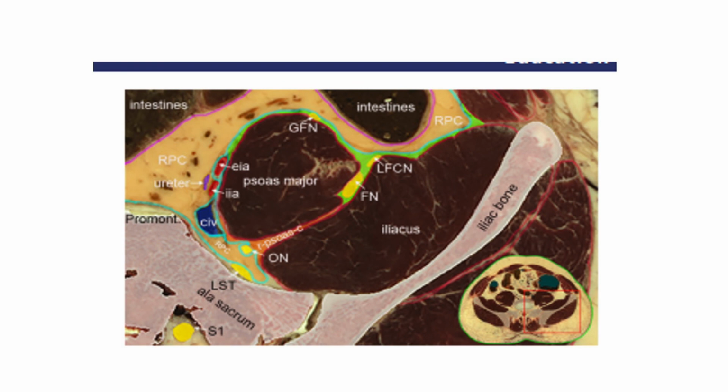So, as we can see here, the fascia iliaca is denoted by this green line. Like this. So when we block the fascia iliaca compartment, we block the lateral femoral cutaneous nerve and the femoral nerve, and also the genitofemoral nerve. But we did not reach the obturator nerve, which lies outside the sheath.